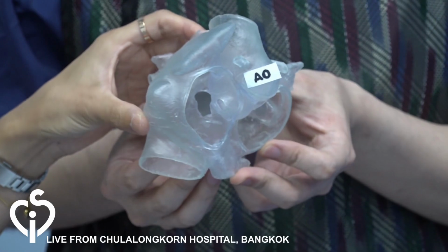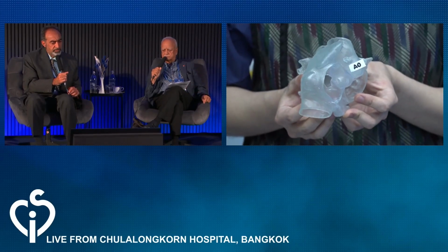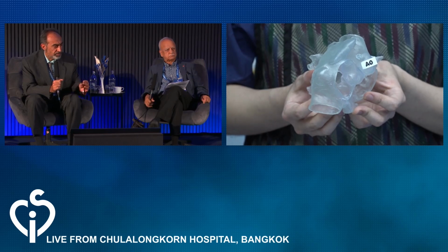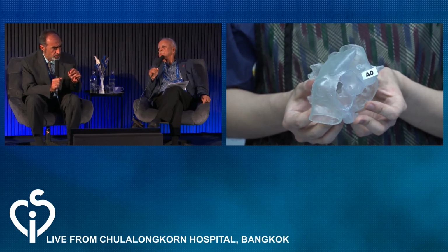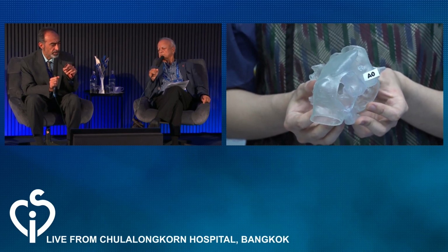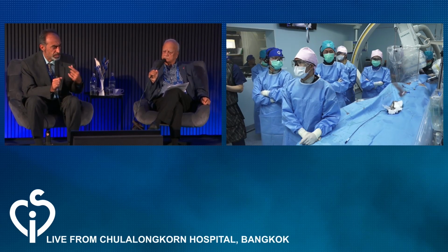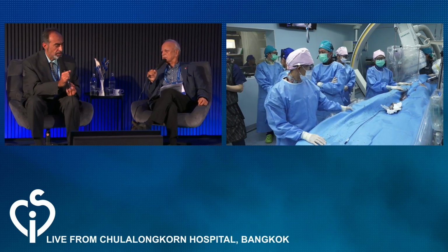Closing it, I think the best thing that we have so far in the market for this would be an ADO2. The size of it, being almost 4 by 6, I probably would go somewhere in between, like a 5 device. There is a 4.4 or 5.4 or 5. I wouldn't want to use something long, like a 6 millimeter width, so I would stick with the 4 millimeter. There's a 4.4. I'm not sure if there's a 5.4, but I wouldn't go too big into a 6.4, for example, because you don't want a 10 millimeter disc on the leaflet.